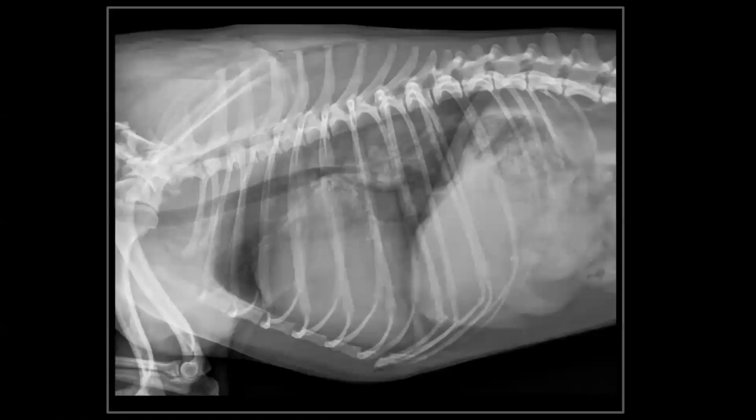Here's another case with a significant caudodorsal infiltration, and there's the mouse. In fact, it's significant enough that you can actually see air bronchograms in the caudodorsal field. Interestingly, as is often the case with cardiac disease, you see a distension right here of the caudal vena cava, because as the heart is not able to push blood out as efficiently as it did before, you get blood backup, and it can back up in the caudal vena cava as well.